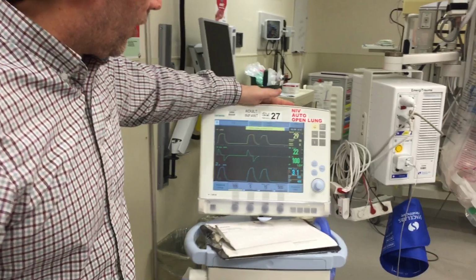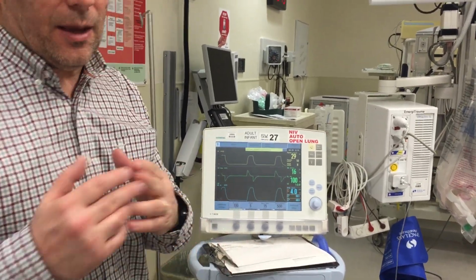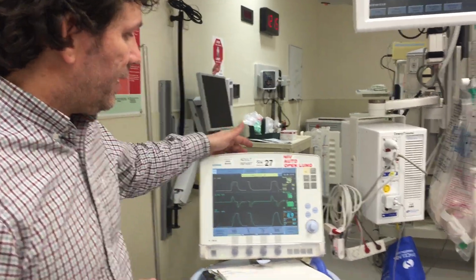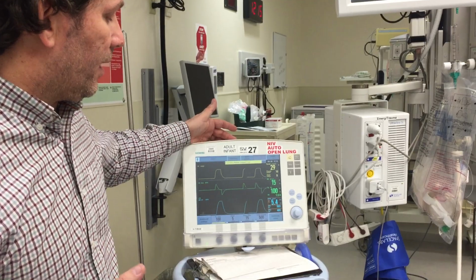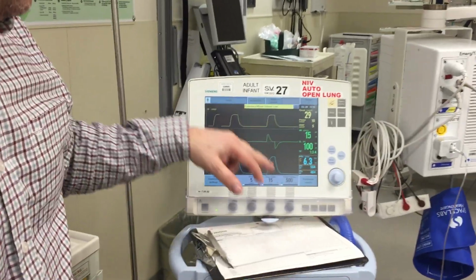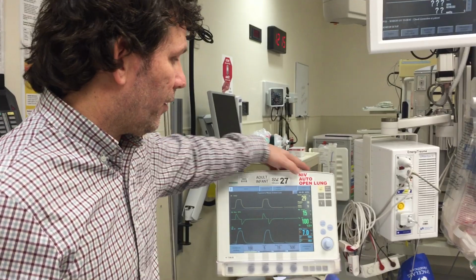So immediately we have an alarm activated. You can see it flashing yellow. It means caution. When it's flashing red, it means that's a really acute alarm. We have to fix that immediately. Yellow is for FYI kind of thing, right? So with our alarm profile, we see that the expiratory minute volume was low, and that was just because it was just registering, and we just set them up on the vent. That's a very typical alarm. Don't be alarmed by it, pardon the pun.